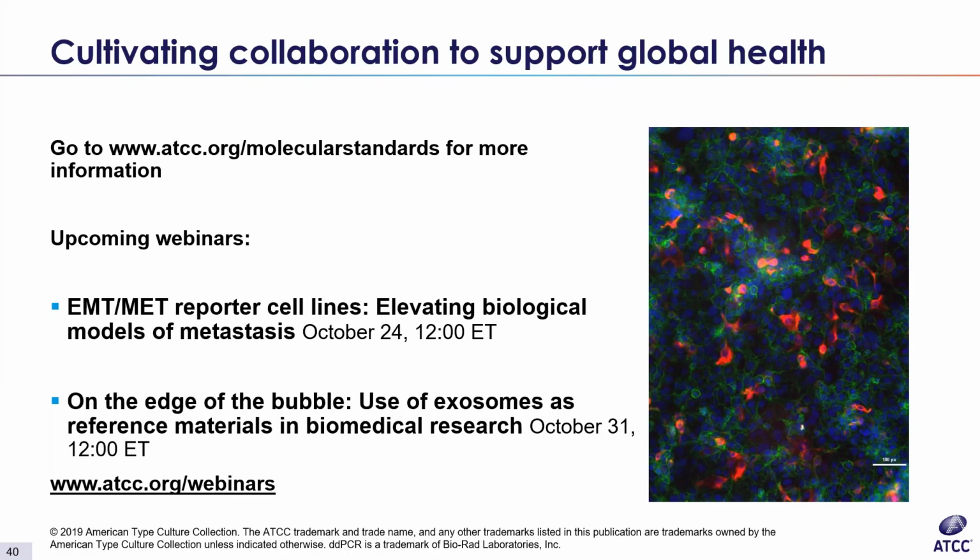Now here's a question that I have. What's a DQ product and what's an SD product? Okay, right. So we did skip over this, didn't we? The suffix to the item number tells you what kind of derivative it is. SD stands for synthetic DNA. A D or a D5 just stands for DNA. The D5 is 5 micrograms. A DQ is quantitative DNA. And we carry that over to RNA products as well, just for uniformity.